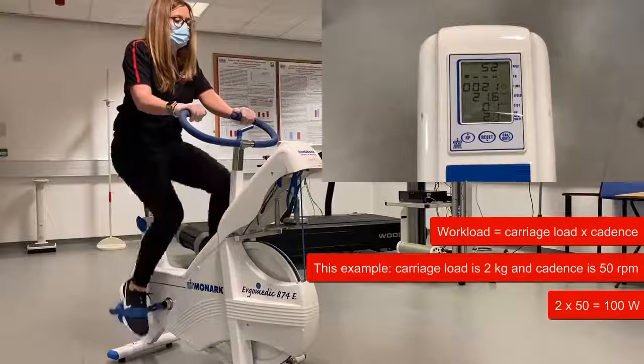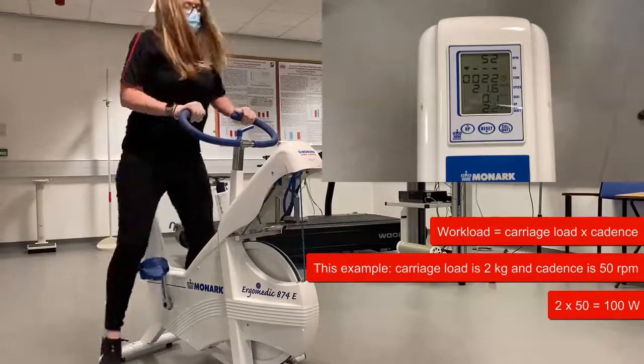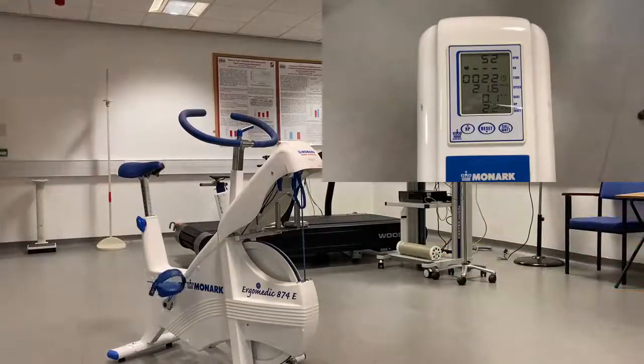This process can be repeated across a range of workloads, in which you can achieve a desired workload by simply multiplying the load and the cadence.